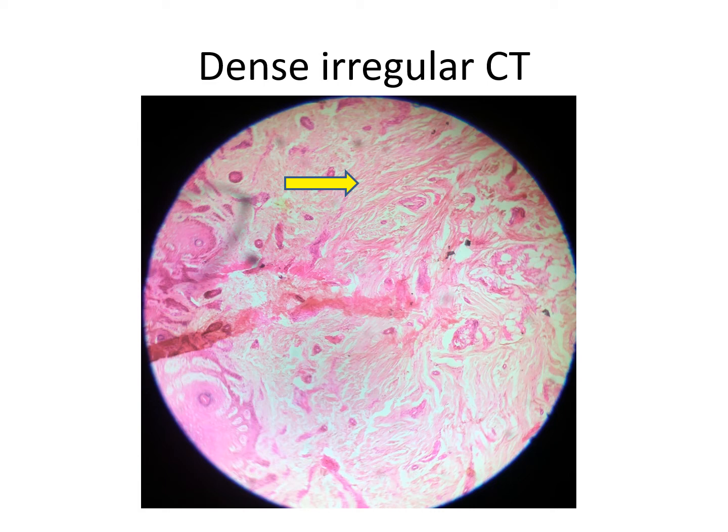Dermis of the skin. Or sometimes there is dura mater, epimysium, epineurium, pericardium, periosteum, tunica albuginea of the testis and sclera, capsule of the various organs, and the submucosa of the intestinal tract. They cover fragile tissue and organs and protect them from multi-directional mechanical force. So these are examples of dense irregular connective tissue.